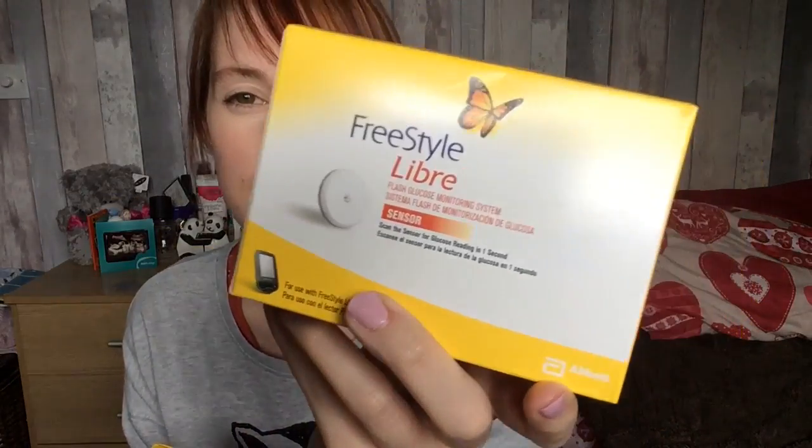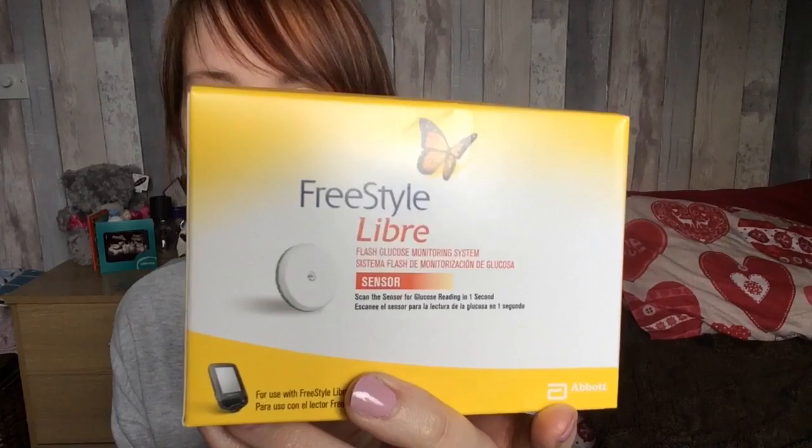I ordered the starter pack, so I got the reader itself, and I also got two sensors. The sensors are said to last up to 14 days, but at around £50 a sensor I would expect them to definitely last 14 days. I would be rather mad if they did fail.